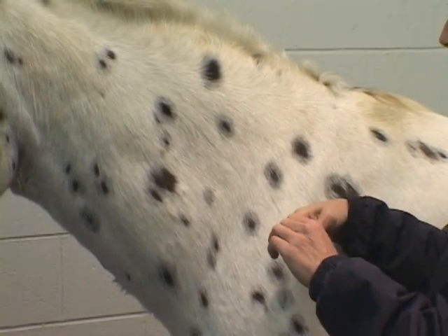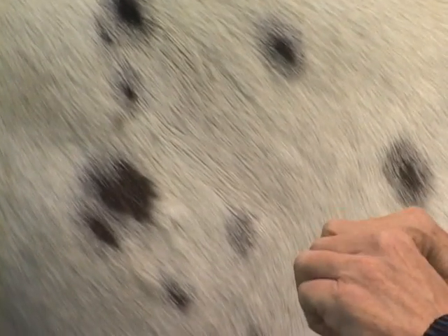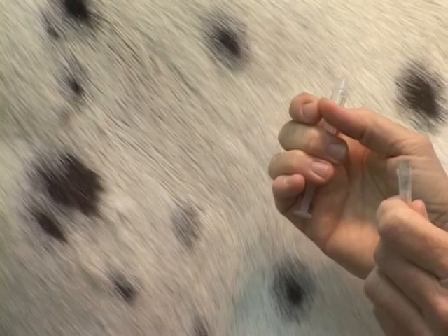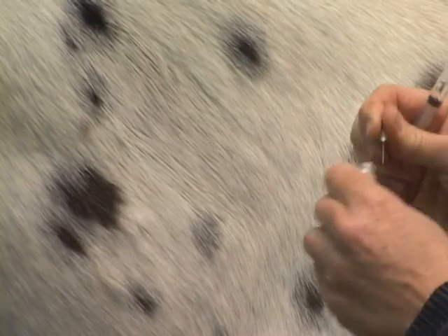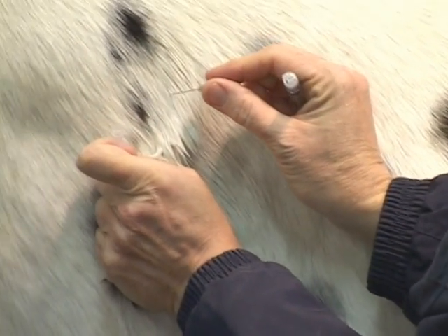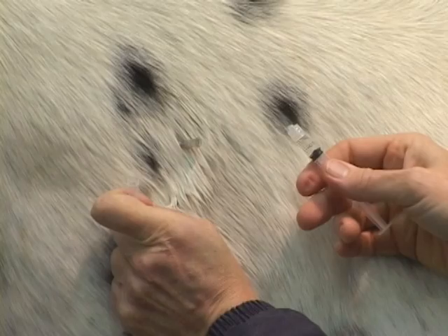I like to take the needle off the syringe. For me it works better because that way, if my patient jumps around, I still have a better chance of that needle staying in the horse and not falling down on the ground. I take my needle off the syringe, I usually grab a little hunk of skin just to stabilize myself, and I just put the needle in. And Checkers says ouch, but he's not really that unhappy with me.